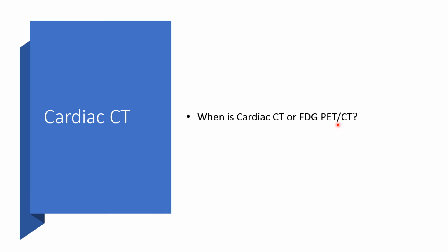Cardiac CT is superior to TTE and TEE for paravalvular extension of infection and abscess. For the evidence of embolization, CT of the head and chest will be better. Though cardiac CT is fine, it is not without demerits or shortcomings. And the shortcoming here is that transesophageal echo, that is TEE, is better than cardiac CT to diagnose vegetation.